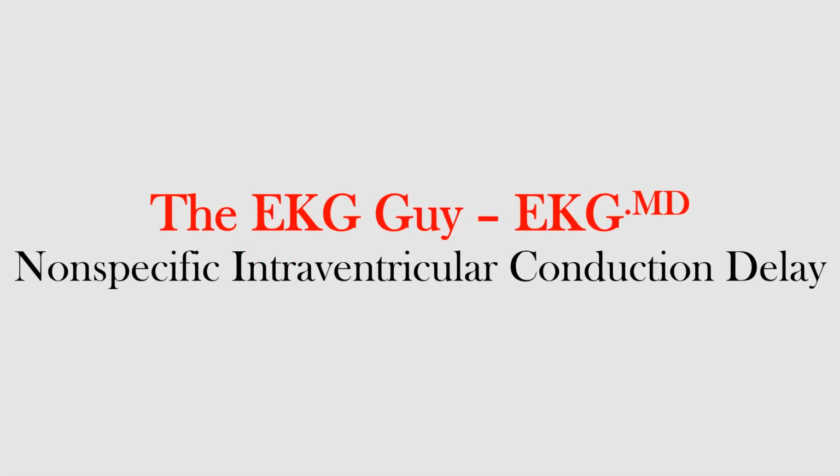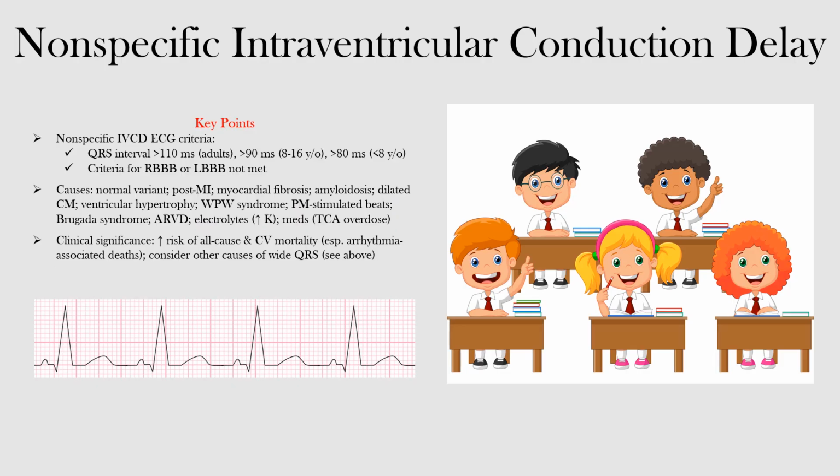In this lecture, we will discuss nonspecific intraventricular conduction delay, including its EKG features, potential causes, and clinical significance. Nonspecific intraventricular conduction delay is defined as a prolonged QRS interval that does not meet the criteria for left bundle branch block or right bundle branch block. Therefore, actually noticing it on the EKG may be rather subtle because we're not seeing any of the wave changes, but instead we're just seeing a widened QRS interval.